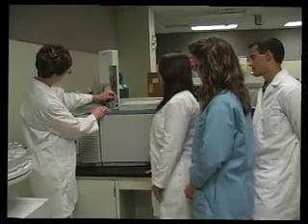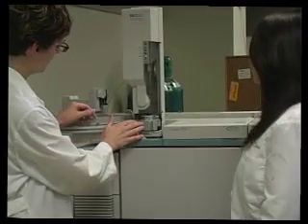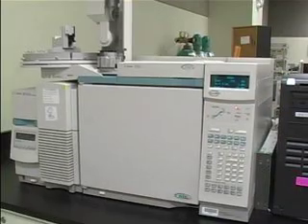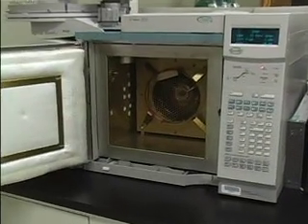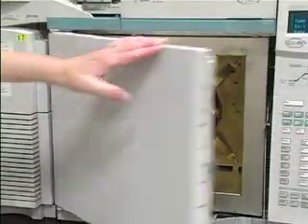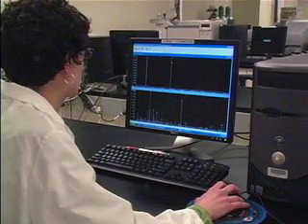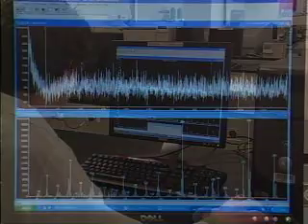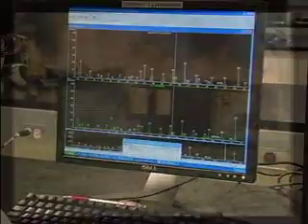Out of all of our instrumentation utilized, GCMS is the most used instrument in chemistry. The GCMS instrument is an extremely large oven. Its method of use involves a liquid sample being introduced into the instrument to get heated, turning the liquid sample into a gas sample. After the gas sample runs through the instrument, a scientist gets data as to how many parts are in the drug sample and a picture of those parts. Those pictures are later compared to a reference for identification.